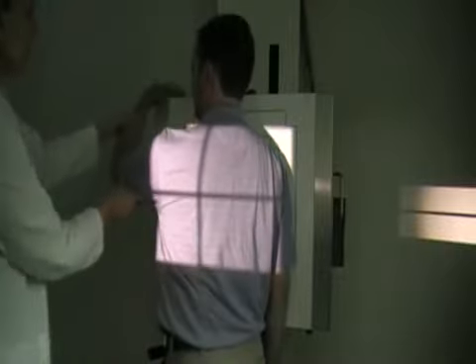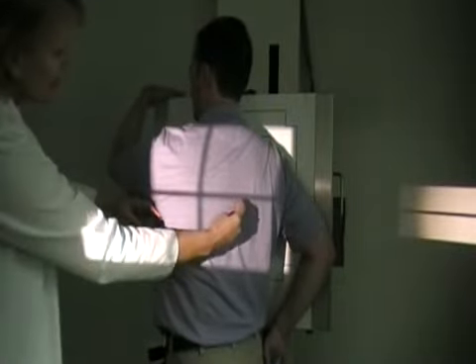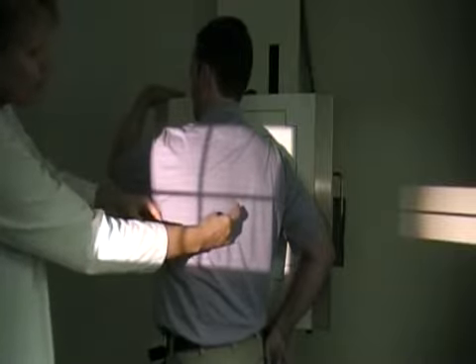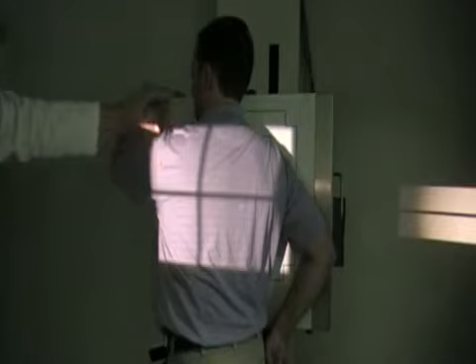So here David is in an RAO. I'm going to bring this arm up, bring this arm out, okay, and then we're checking our central ray. It's going to be halfway between the spine and the lateral border, and we are including both sides, as you see here. Okay, but this is going to demonstrate that left lung the best.